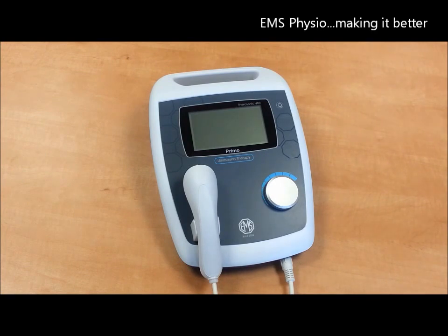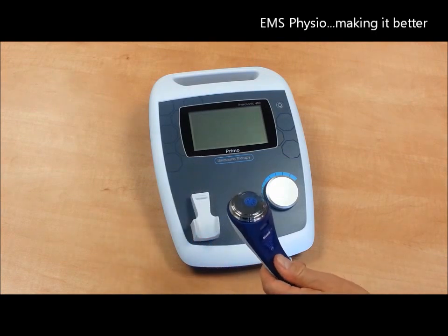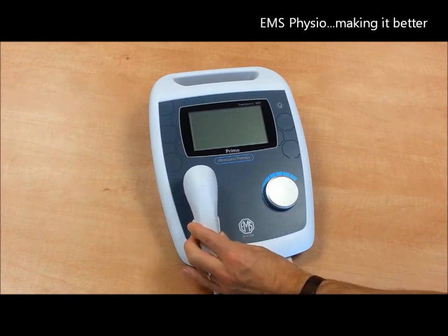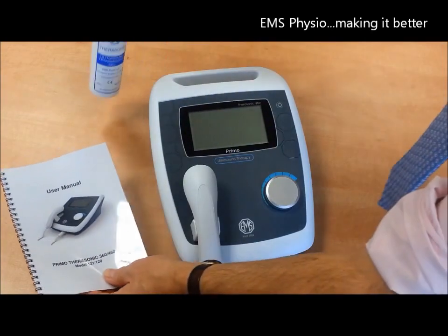Each unit is supplied as standard with a large treatment head which offers dual frequency output at either 1 or 3 MHz. Additionally, a starter pack of ultrasound gel is provided as well as a comprehensive user manual.